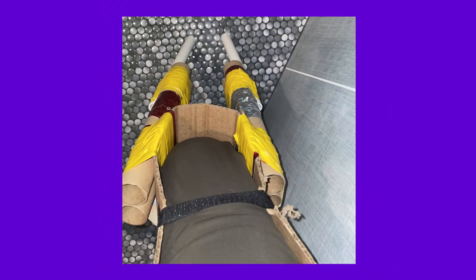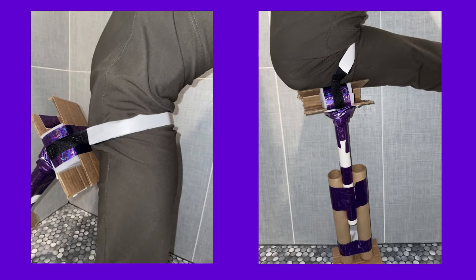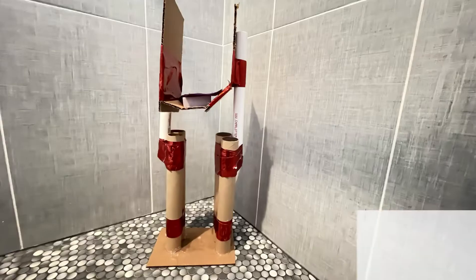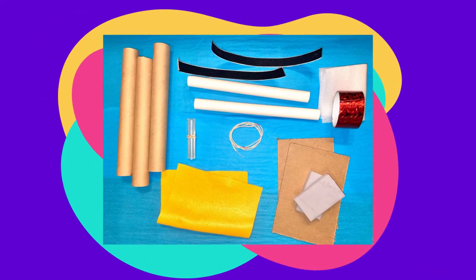There are clearly many different ways to go about this one, and remember you can always rewind this video to come back and take another look at these examples. Here are some of the materials that you get to get the job done — you're free to be creative and use your materials however you'd like.